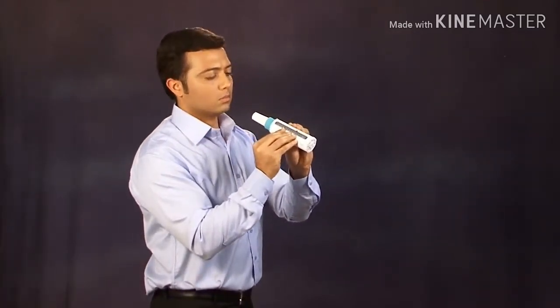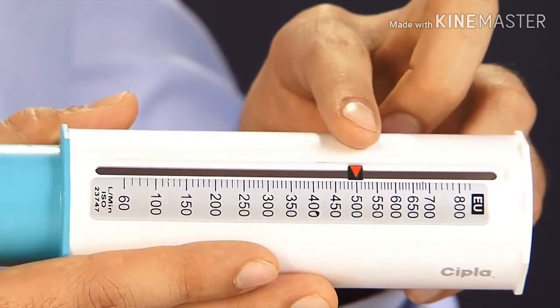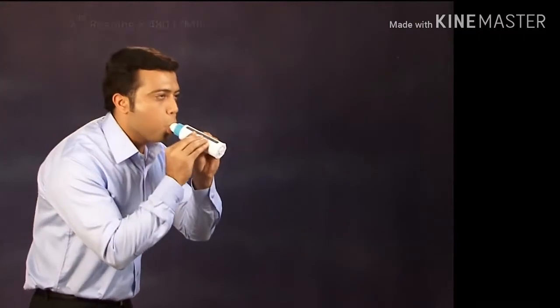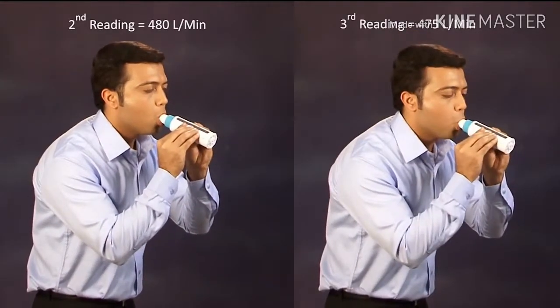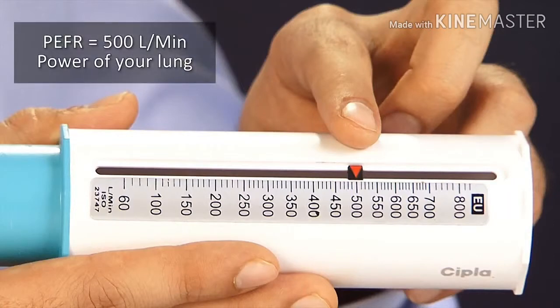Just like you blow out candles on your birthday cake all at once. The number where the pointer stops is your first reading — that is PEFR, peak expiratory flow rate. Note it down. Repeat the above step twice so as to obtain three readings. The highest of the three readings is your PEFR reading, which indicates the power of your lungs.